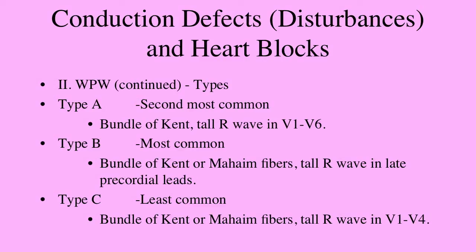So that concludes the information on WPW. Again, this is a syndrome or conduction defect caused by having a pathway that is active going around the AV node, and generally that should not be present or active as a pathway. It leads to a short PR interval and a delta wave, and it's something where the AV node delay does not exist.